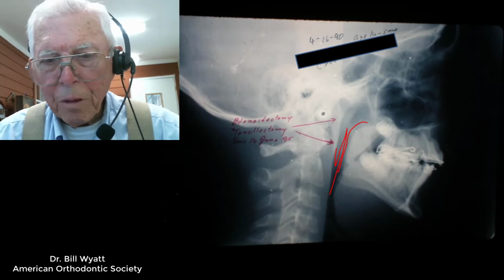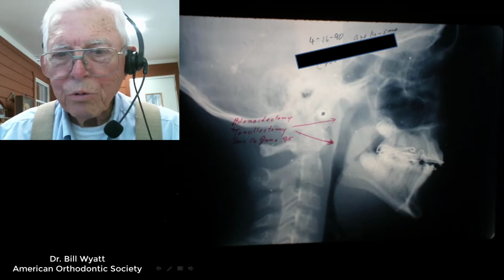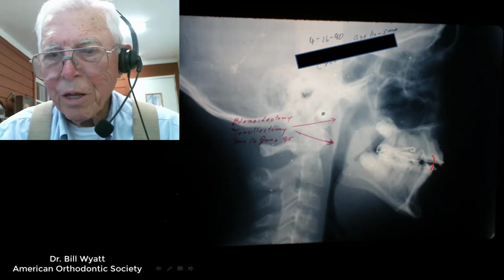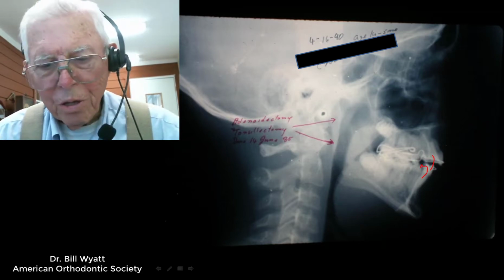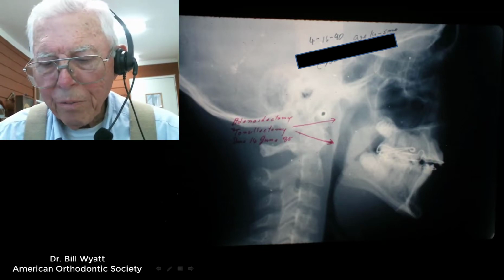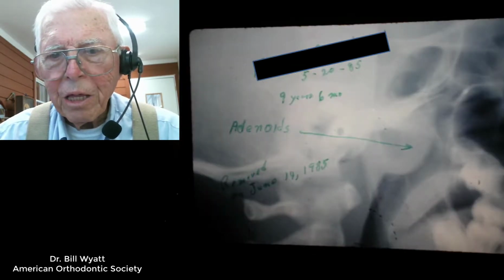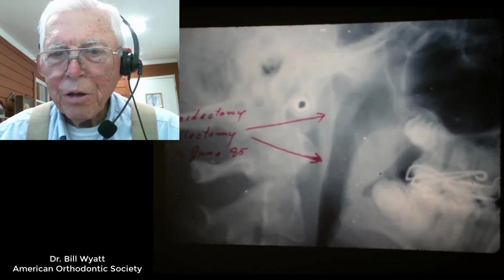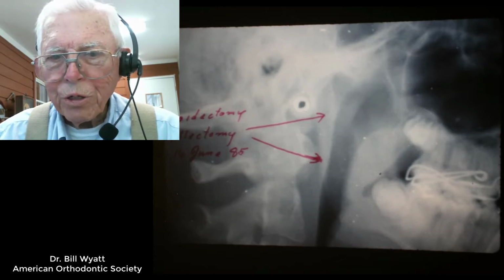He's so used to breathing through his mouth, and now just breathing through the nose, and we were able to bring his teeth back into alignment and stop the thumb and the tongue thrusting, and we use these little fingers on the tongue thrust problem. The fused tooth made a little bit of a problem for that. Now there's the adenoid tissue kind of blown up, and there it is gone. And so it opened the airway considerably.